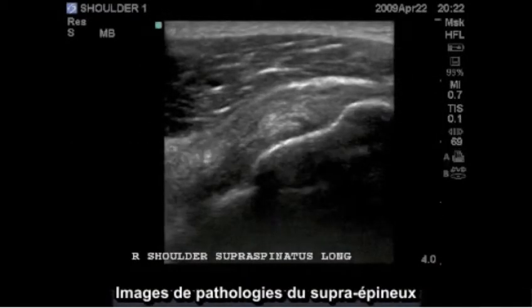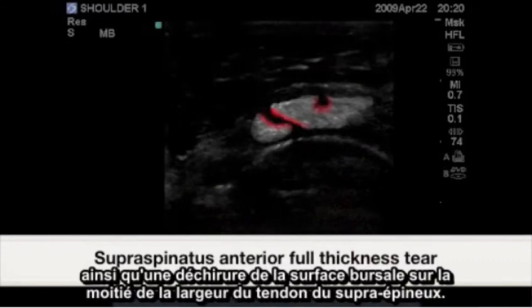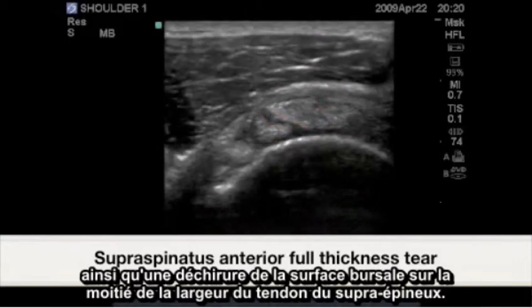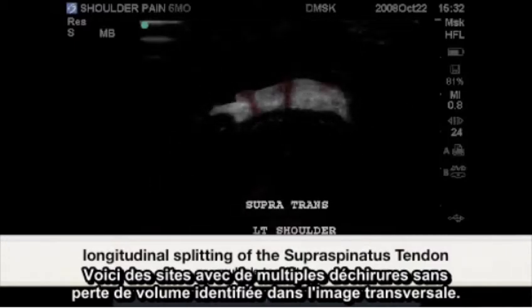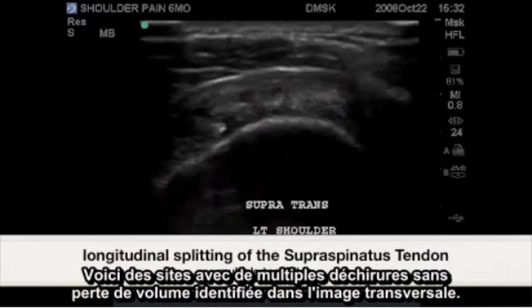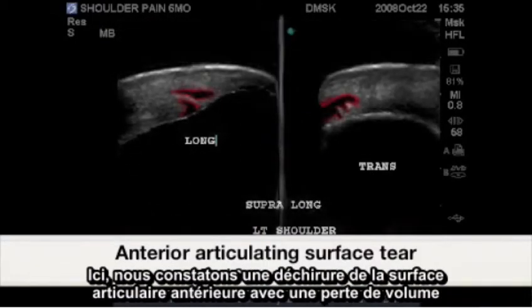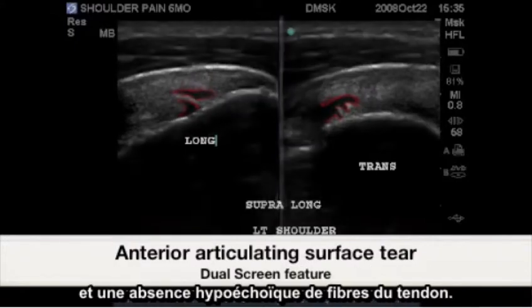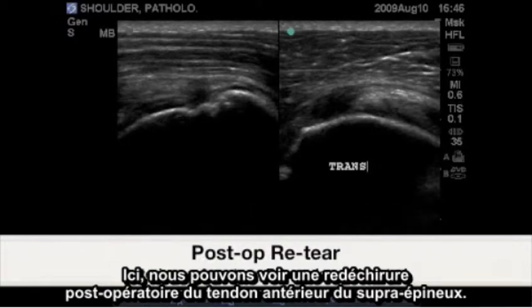Supraspinatus pathological images. This image demonstrates an anterior full thickness tear as well as a bursal surface mid-segment tear of the supraspinatus tendon. Here we have multiple tear sites with no volume loss identified in the transverse image. Here we have anterior articular surface tearing demonstrating volume loss as hypoechoic absence of tendon fibers. Here we have post-operative re-tear of the anterior supraspinatus tendon.